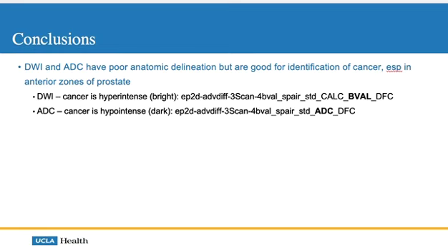So I would encourage you all to look at these MRIs. Don't just look at the report. Get a real sense for them. Practice looking at them. The more you look at, the easier it becomes to identify these cancers. And then hopefully in some subsequent lectures, we'll talk about PI-RADS, grading, and also talk a little bit about margins, margin status, and staging. Thanks very much.